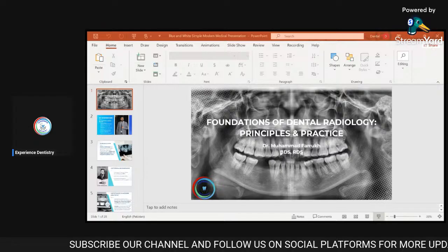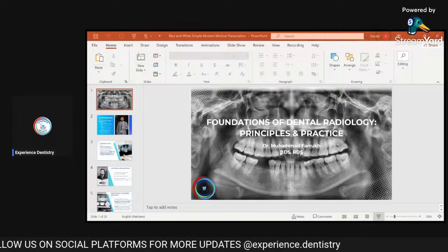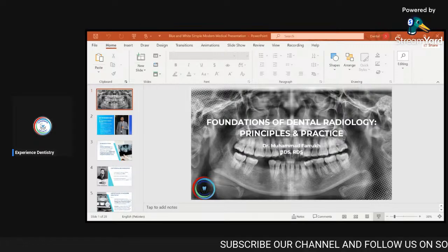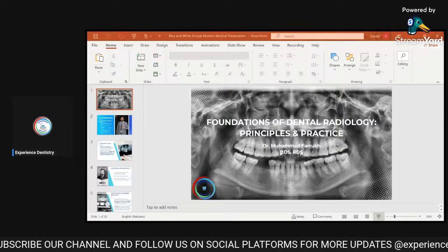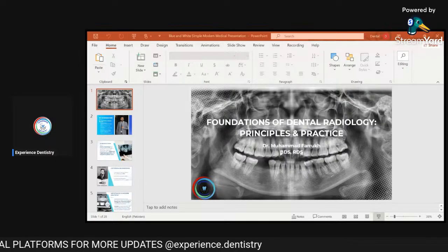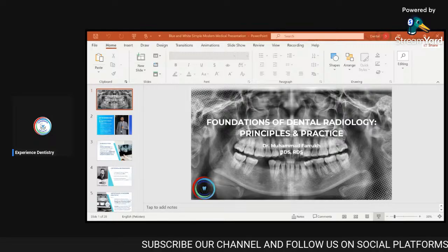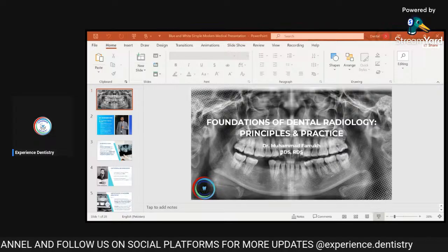When you need to detect a caries, as you can see in the picture, this is a molar, the first molar, the 6th one, and there is a caries in it, exposing the pulp on the distal side. In this case, a patient will present with pain in a molar, and he will say the pain is not going away. So you assess that it is an irreversible pulpitis case. For the confirmation of your diagnosis, you have to go towards an X-ray. And this X-ray confirms that this patient is a case of irreversible pulpitis, and it basically needs a root canal option. So for the confirmation, you are going towards this.